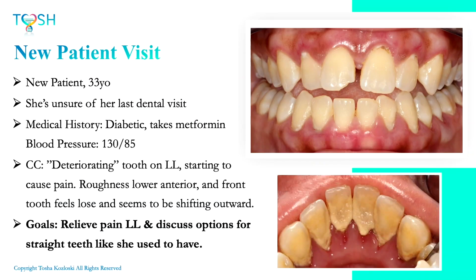So let's look at a few case studies. Let's pretend this is your patient on Monday morning, and now you have a microscope. A 33-year-old woman comes in. She's unsure when her last dental visit was. She's diabetic and she's taking metformin. You take her blood pressure, it's 130/85. She was completely unaware of high blood pressure. Her main reason that she came in is that she has a deteriorating tooth on her lower left. She's not really sure what's going on.